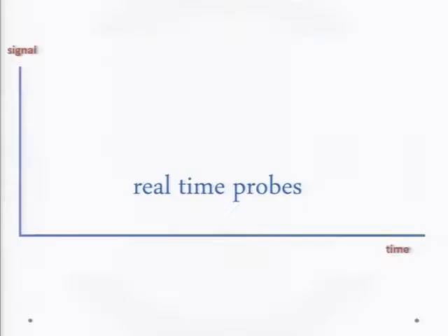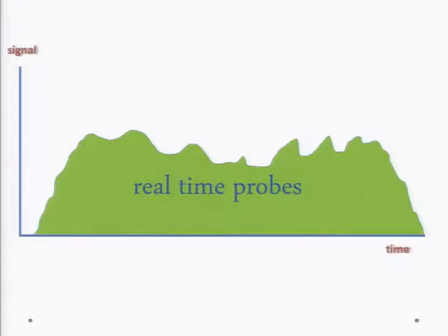So I want to introduce real-time probes, and when I started the ICRU process, sadly 10 years ago, I thought that we could, you know, the reality is the dose in CT is dynamic. You have the X-ray tube rotating around, you've got all this dynamic stuff going on. The notion of using a static chamber that only integrates over and over and over again seems a little old-fashioned to me. And so I worked with two vendors, actually, and one of them was a solid-state group. And I think we all prefer air ionization chambers. But then I worked with Paul Sunday at RadCal and MDH, and that's what I'll describe here.